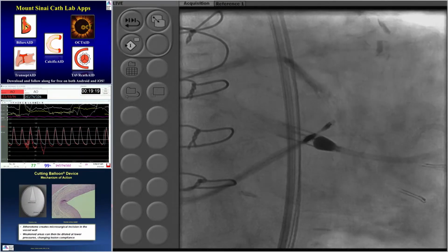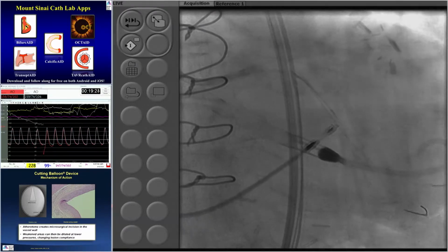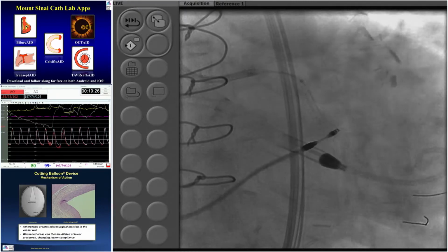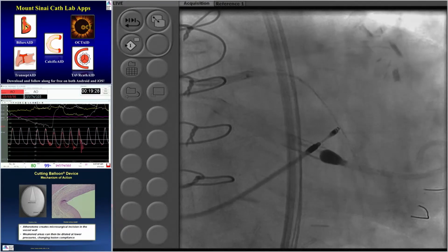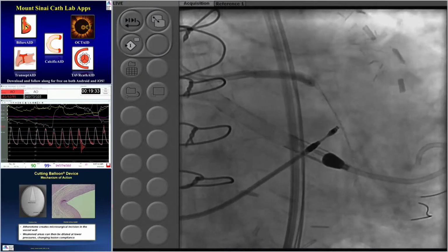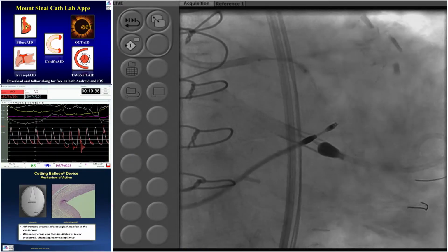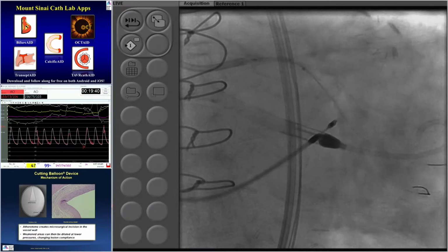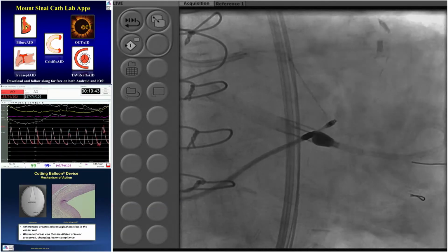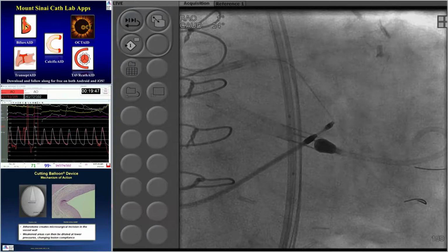That looks like it's opening nicely. So clearly, in this case for the left main, we'll use a 3.5 or 4.0 Wolverine to open it up further. I think for the left main, the cutting balloon is a good idea. And then, I didn't really see so much of a need for the full circumflex and OM to be fully dilated. I saw a very focal lesion in that circ, but now it looks like, are you committing yourself to stenting a long segment there or no?